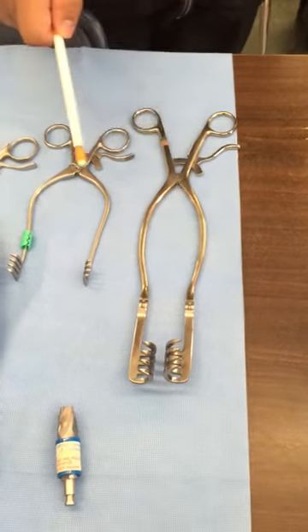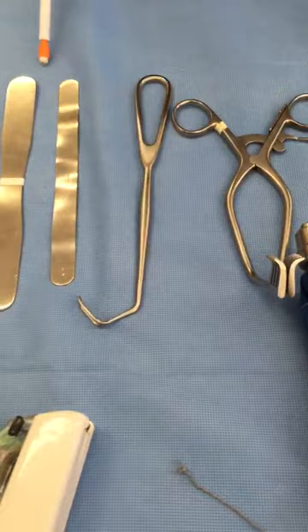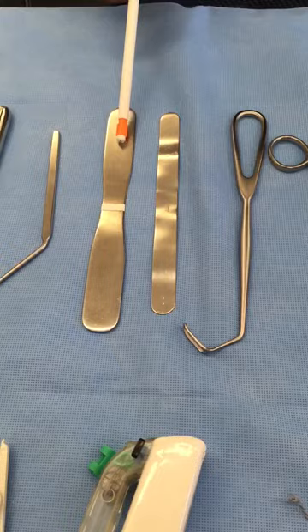Beckman. Straight Adson Cerebellar, Angled Adson. Cushing Decompressor Retractor. Davis Brain Retractor. Davis Brain Spatula. Love Nerve Root.